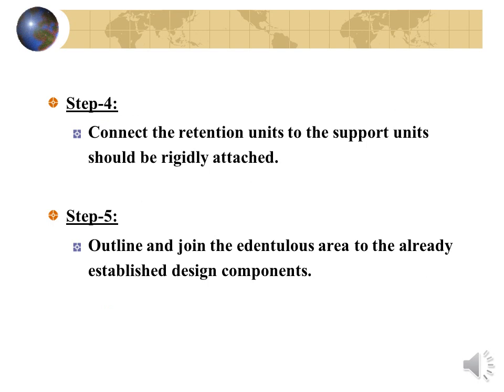The fourth step is to connect the retention units to the support units. If the direct and indirect retainers are to function as designed, each must be rigidly attached to the major connector. The fifth and the last step in this systematic approach to design is to outline and join the edentulous areas to the already established design components.